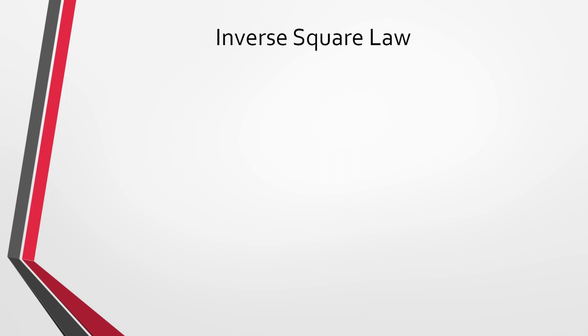As primary control factors, we set two at the console: we set the kVp, and we set the mAs. Then distance will have the other biggest impact on the actual exposure, how much is eventually going to reach the IR. That we can control. All right.